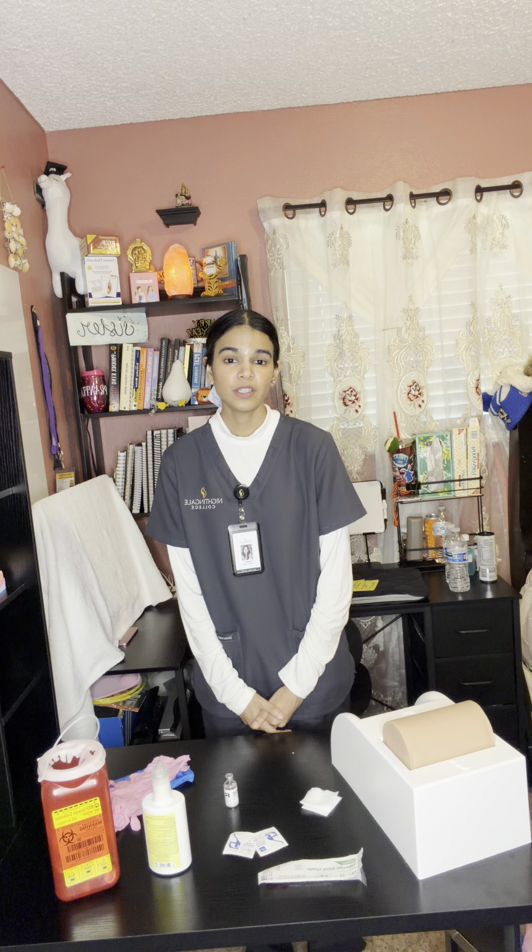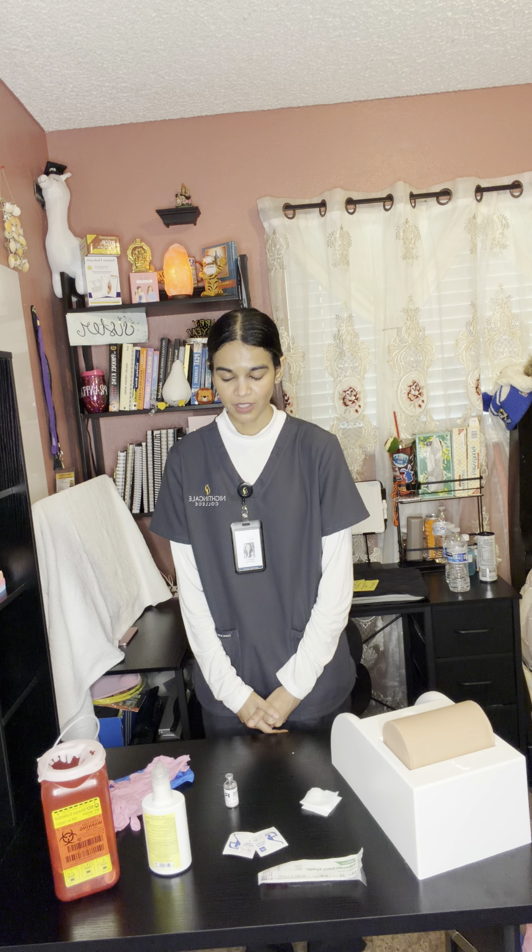The second thing we're going to do is verify the 6 rights of medication, which is the right patient, the right drug, the right dose, the right time, the right route, and the right documentation. After that, we'll verify the physician order with the EMR. The physician order states 5 TU per 0.1 ml, and the medication does match that. We'll gather our supplies and head towards the patient.